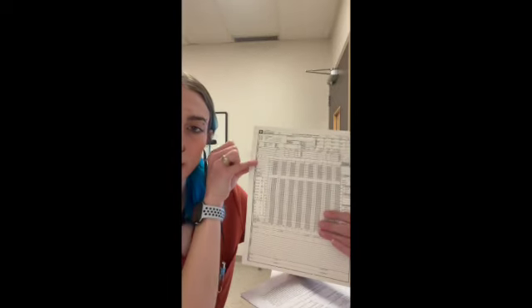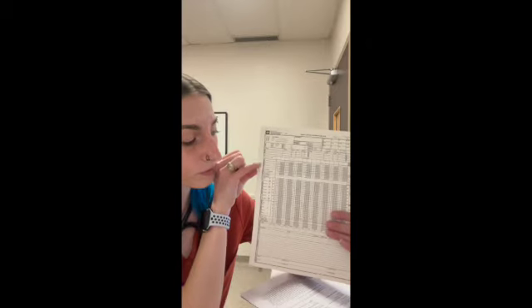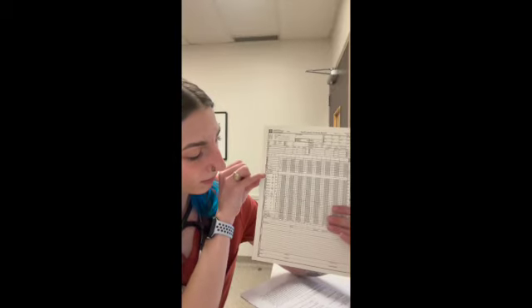So here in this section is going to be our fluids and CRIs that our patient will be on during the procedure. This section here is going to be our inhalant gases and what percentage they're at. And then right below that is where we start putting our event codes. For example: patient was induced, patient is now getting wet prepped, patient is now rolling to the OR, patient is now getting drape prepped. So that's what the event codes mean.